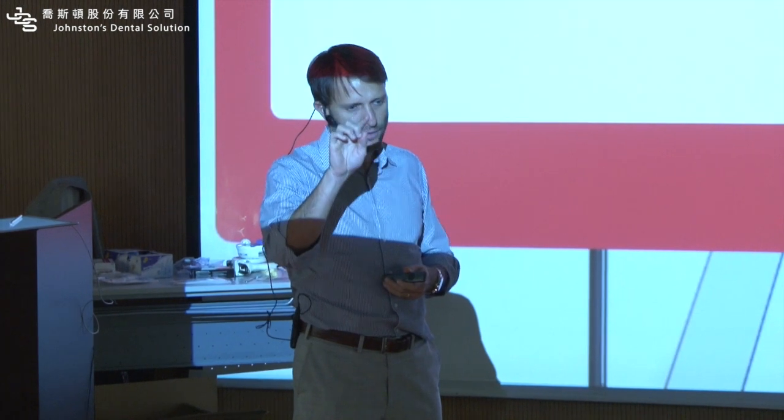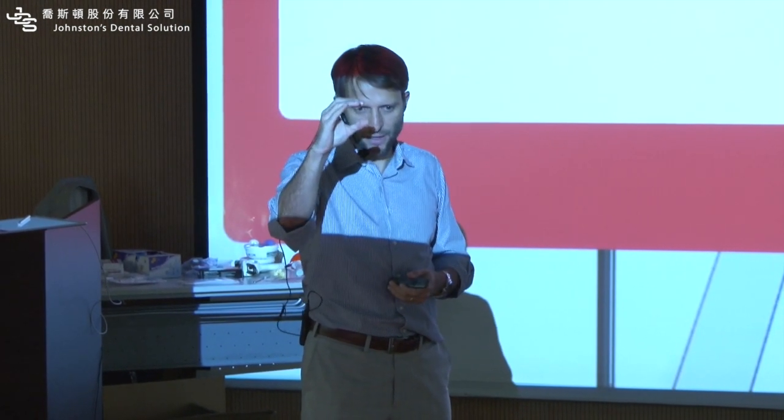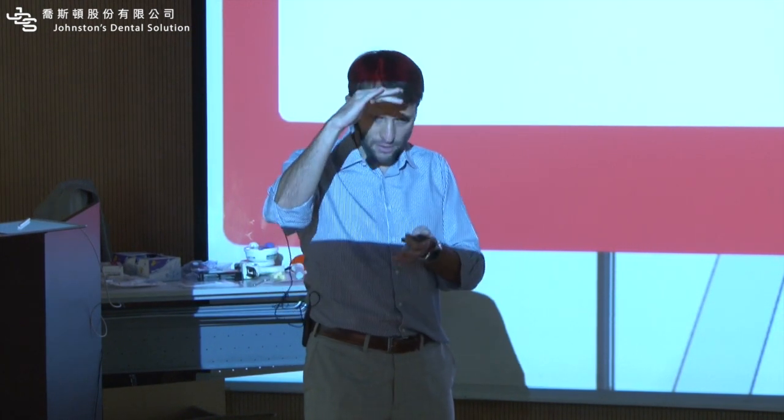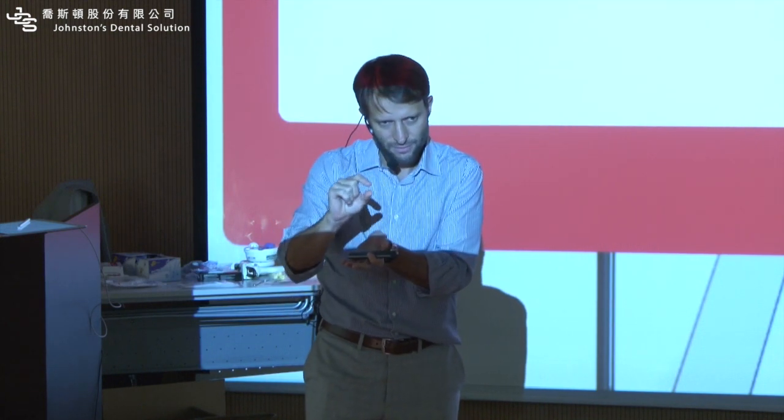Go to digitalsmiledesignapp.com to be able to create an account and download from the App Store. If you go to the App Store now and search DSD app, you're going to see the app there. You're going to download it and open it, but when you start to try to work, a window will open saying password.